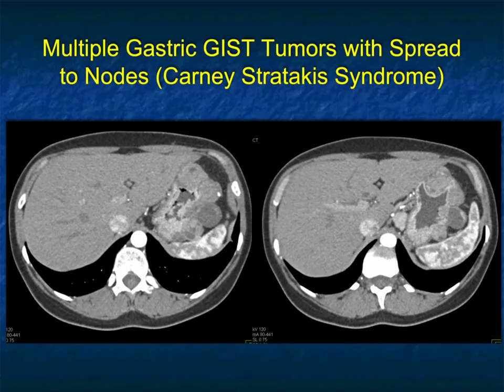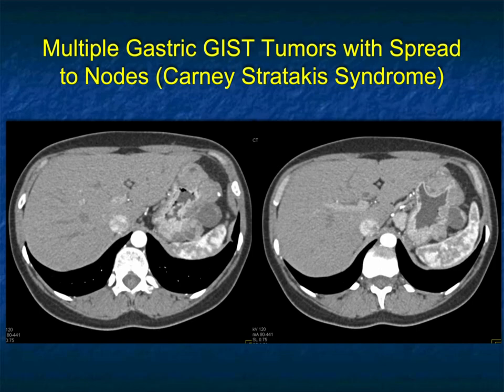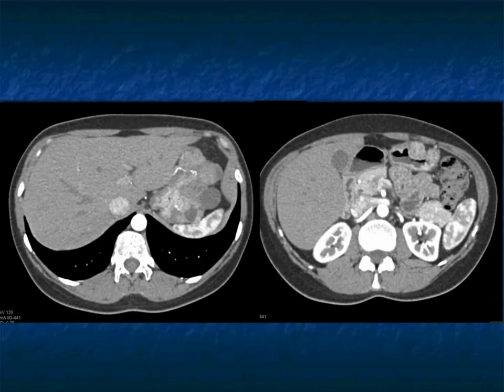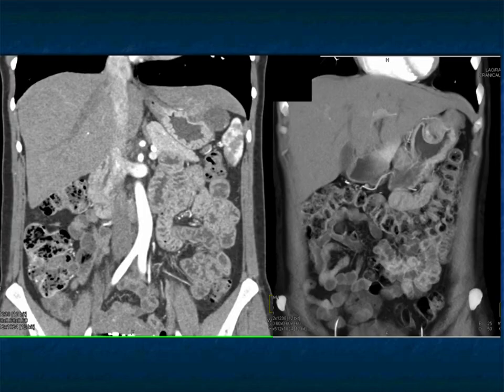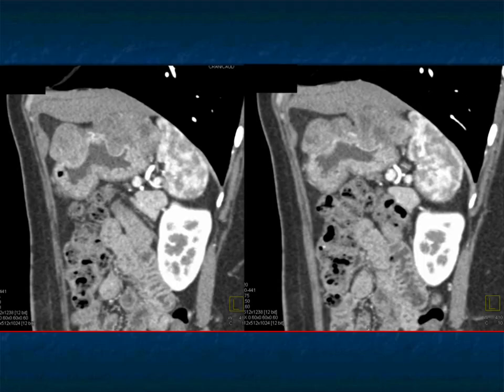When we talk about GIST tumors, I mentioned the large exophytic mass. I never thought about GIST tumors being multiple — but there is a syndrome, Carney-Stratakis syndrome, where you have multiple gastric GIST tumors. You can see them here: multiple submucosal lesions, most are solid, some are cystic. On the coronal views, some push intraluminally, some are extraluminal. Multiple lesions, some going submucosal.